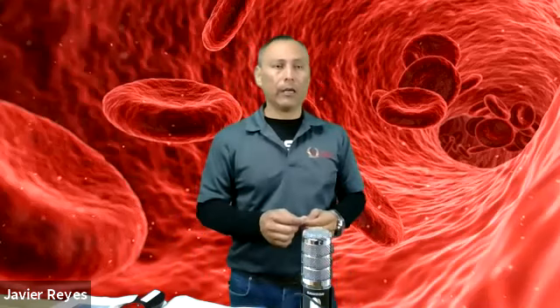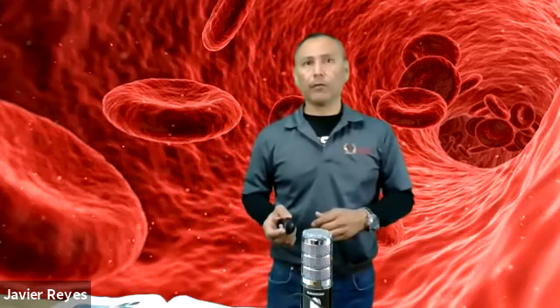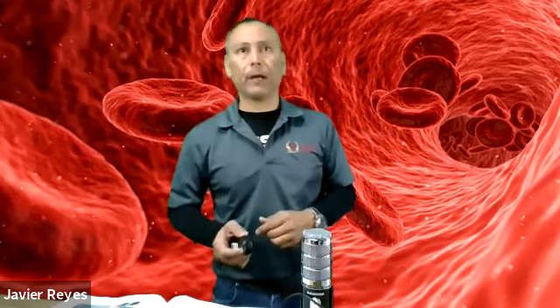Now remember never to puncture an infant more than 2 millimeters deep. You need to remember this. Never more than 2 millimeters deep, as you might cause injury to the bone. And if they get an infection, you cause something we call osteomyelitis, or if it's in the joint of the bones, then you might cause osteochondritis. Those are two terms that you need to be familiar with, as they are part of your terminology in this chapter.